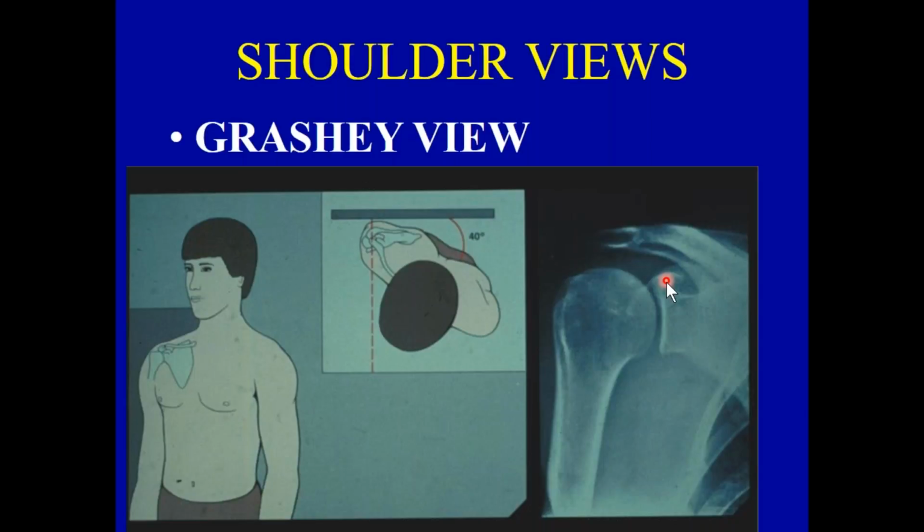Another helpful hint in taking a good shoulder x-ray is the position that is seen here where the laser pointer is. This is the glenohumeral joint. This provides us information about if there's any way that the shoulder is locked. You've aimed at about right here, which is the coracoid process, and we've talked about how to find that.